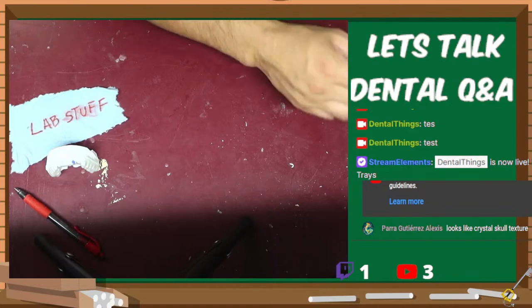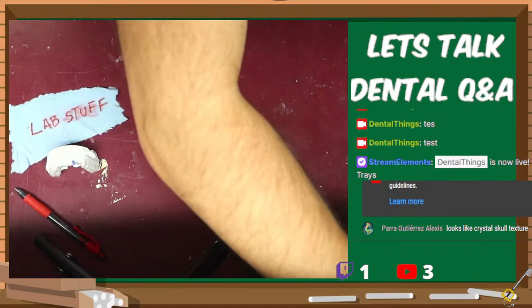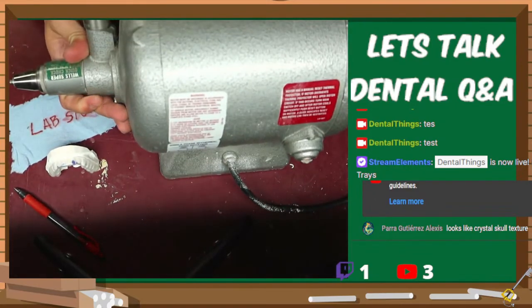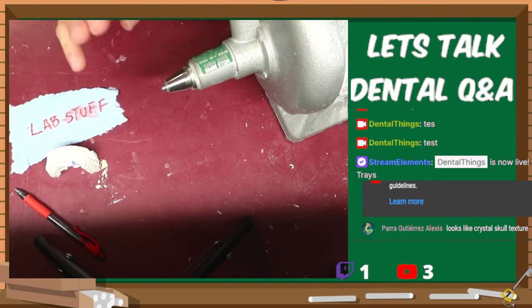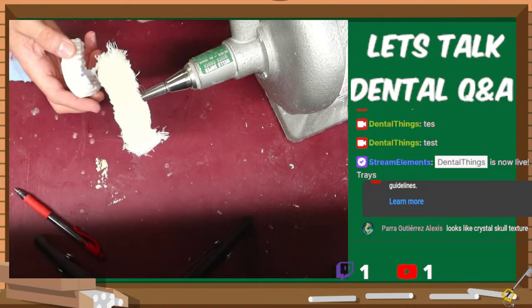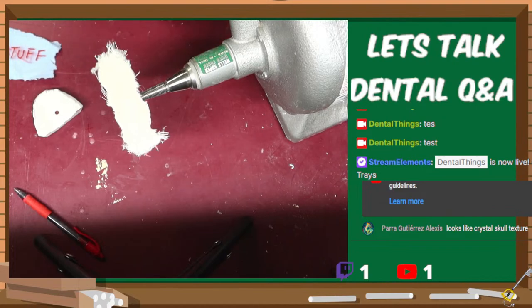Let's see, I can go and, this is gonna be a bit of a lift. I need to get a small little rag wheel. Ugh. Man, that's a beefer. Cool. Now that I got my lathe in place, let's find the rag wheel that I want to use, which is going to be here. And then if I get my model, I could shine it on this cast. It'll actually make it a lot easier to hold as I turn it around. So that's gonna be a nicety.